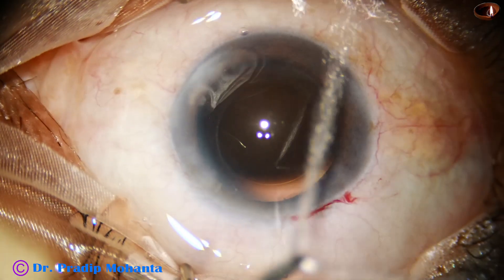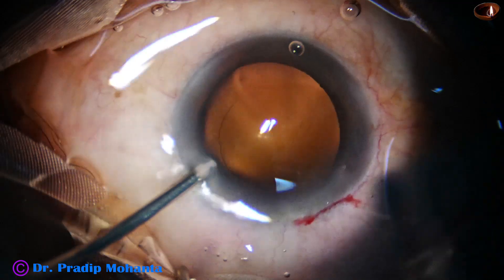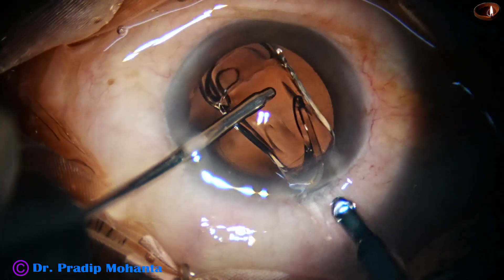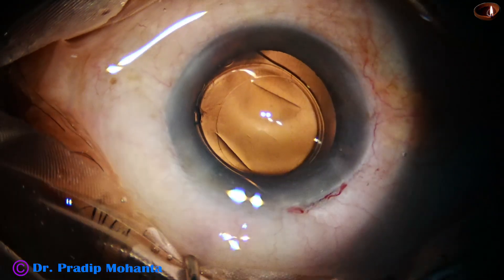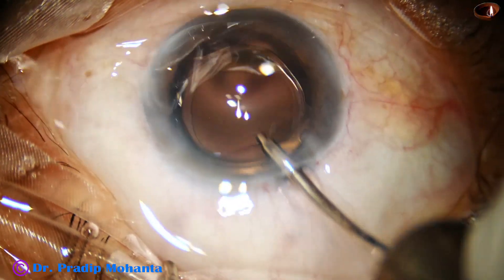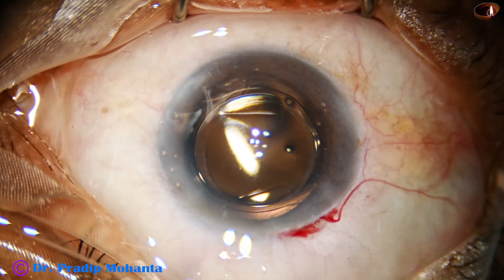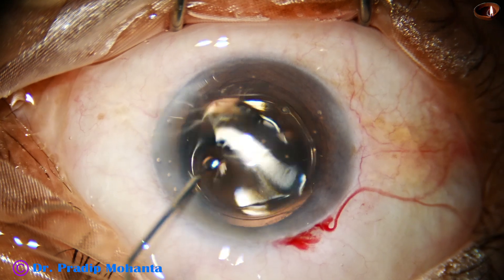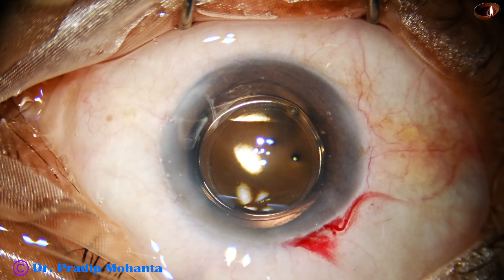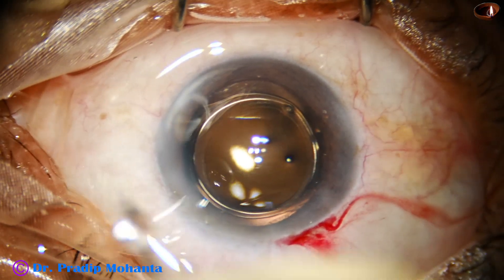The main wound is enlarged a little bit, and using a B-cartridge, a monofocal single-piece intraocular lens is implanted in the capsular bag. Since the size of the rhexis is on the smaller side — about five millimeters — the anterior capsular rim is overlapping the optic all around.